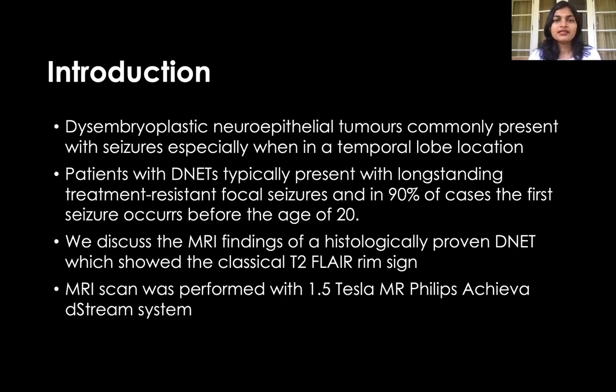Introduction. Dysembryoplastic neuroepithelial tumors commonly present with seizures, especially when in a temporal lobe location. Patients with DNETs typically present with long-standing treatment-resistant focal seizures, and in 90% of cases, the first seizure occurs before the age of 20. We discuss the MRI findings of a histologically proven DNET, which show the classic T2 FLAIR rim sign, and this was performed with a 1.5 Tesla MR Philips Achieva machine.